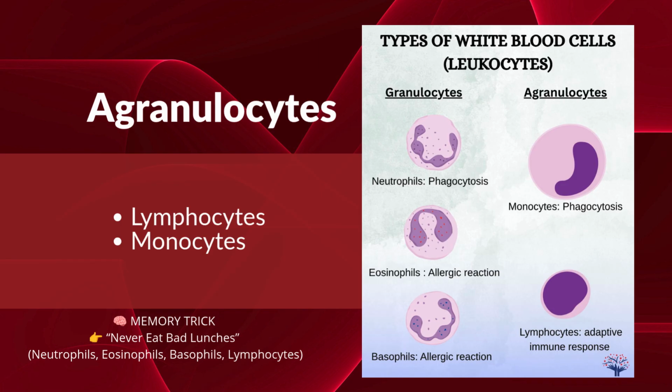All right, so let's talk about the morphology of agranulocytes. We're going to talk about their size, nucleus shape, chromatin pattern, cytoplasm amount, and color. You should be able to tell lymphocytes from monocytes, and blasts from reactive lymphs.